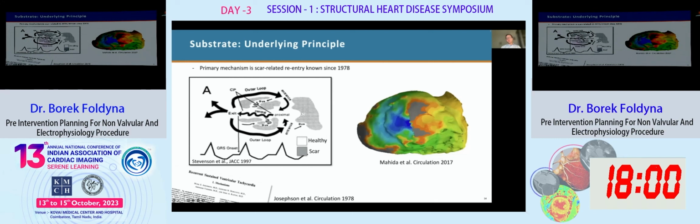And what can happen is that at the end, when the impulse reaches the exit, it can actually go backwards and lead to a re-entry. And on the right side, we have actually CT-based imaging, which simulates the re-entries. Let's play it on, and you can see here nicely how the VTs can be visualized using this computational method. Here, gray is the scar, and we see a circular kind of re-entrance into this channel here in the middle.